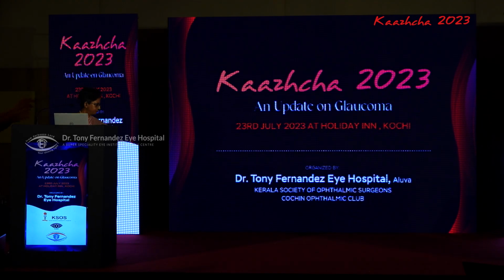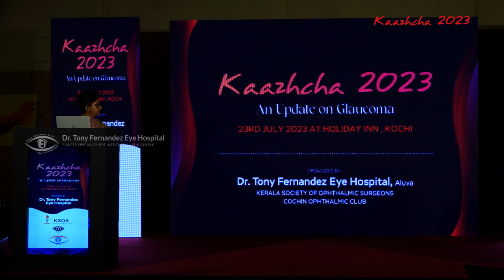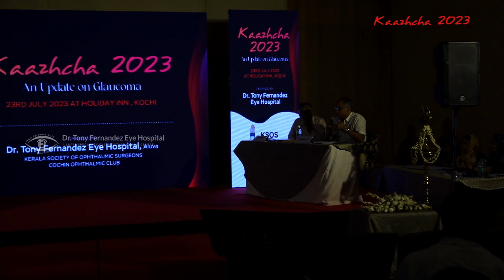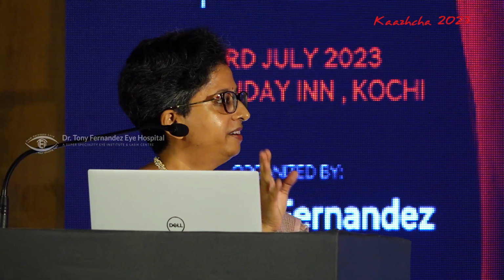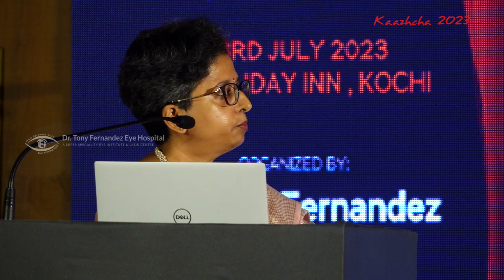Thank you, ma'am. Wonderful practical tips and wonderful videos. Now, a few questions. In a deep set eye, would you like to do a temporal side incision or a superior? Temporal incision. Okay, because most of your incisions appear to be... I prefer a superior incision usually, but fine, I will definitely remember and try to make it temporal. And regarding topical versus local anesthesia, apart from subtenon, do you do subtenon? I do subtenon, but I prefer topical with sedation, because we have the luxury of having an anesthetist throughout. So topical with sedation is something that I prefer, and if I need to supplement, posterior subtenon.